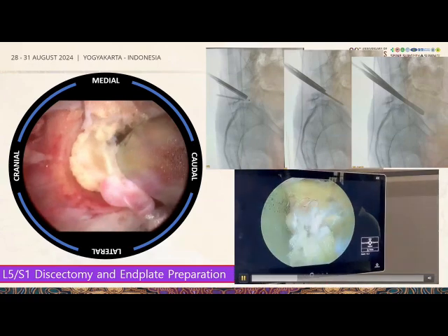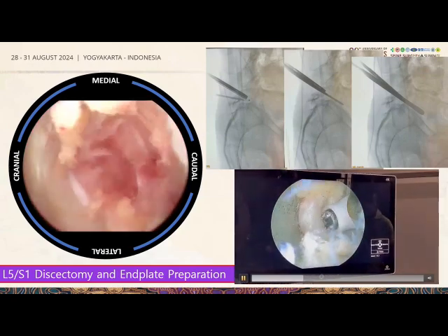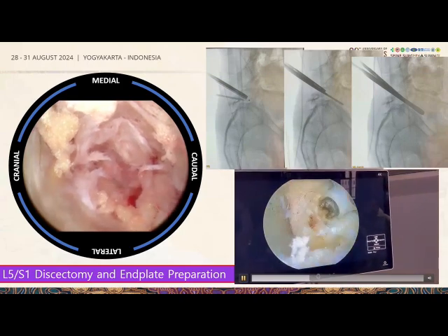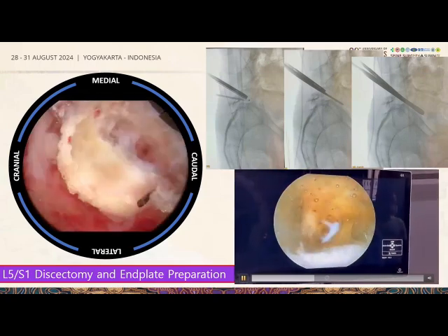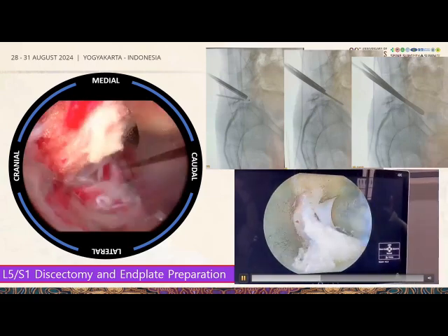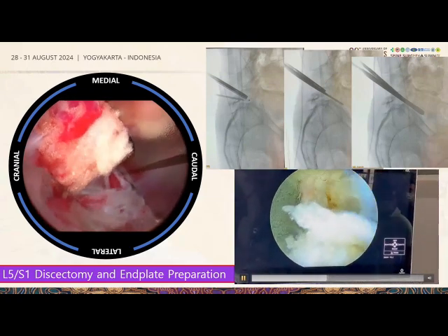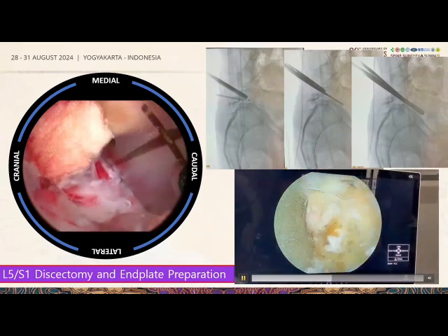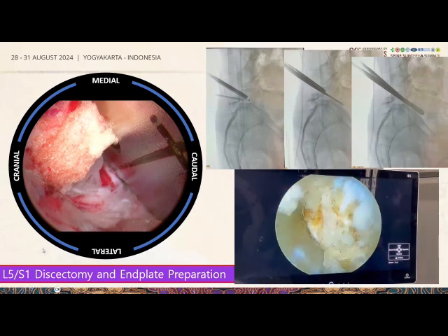In a grade 2 listhesis, the disc is often rather empty with not much disc material inside. The challenge is achieving the correct trajectory without violating the endplate. We use forceps to clean up, applying radiofrequency only to the posterior third where fusion does not necessarily take place. We then insert the cage inserter and bank the cage in.